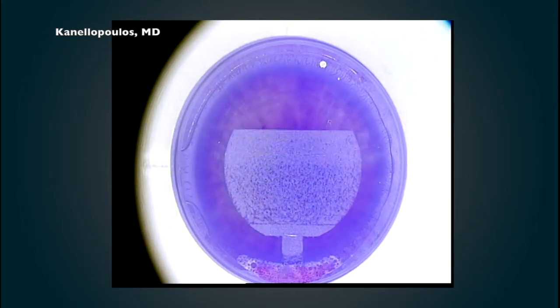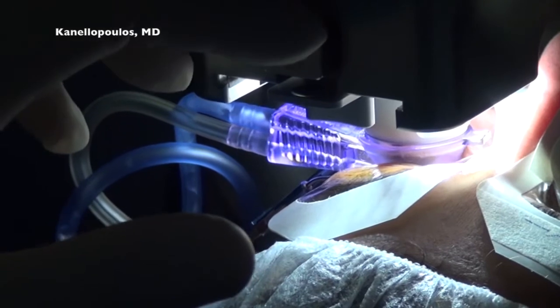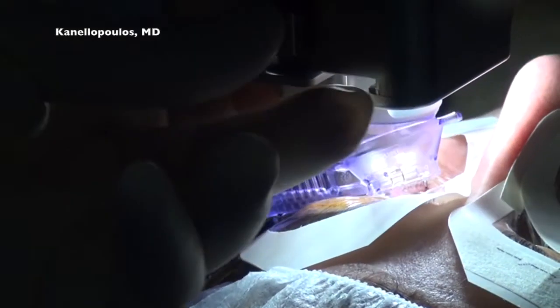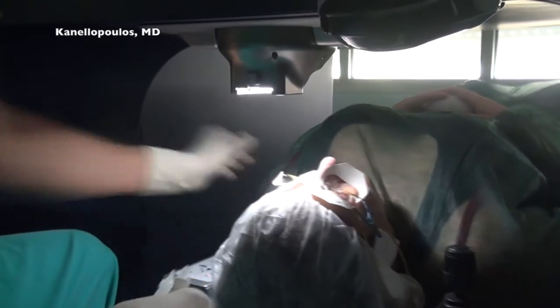Here we're seeing the flap creation on the left eye. See how fast this is. You can see the chimney that vents the gas that's created by the millions of femtosecond laser created bubbles. We are using the 110 microns flap, to congratulate our patient.